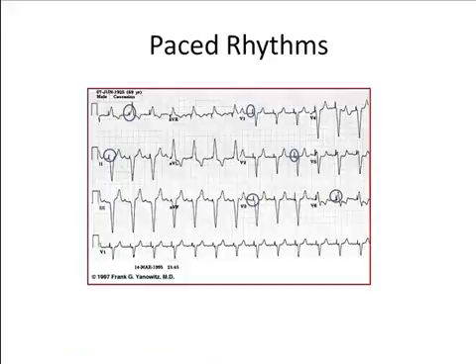Paced rhythms create ST elevation when no MI is present. Here, in this strip, the pacer spikes are readily apparent, but that is not the case in all paced rhythms. Acquiring a 12 lead on a patient who is known to be paced is not necessary due to this common mimicker. In other words, if you can easily detect the pacer spikes in your 3 lead, then no information from the 12 lead strip will help you determine if this patient is a cath lab candidate, except if you look for specific criteria in waveform morphology that we will discuss later.